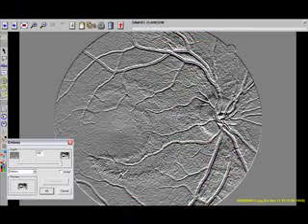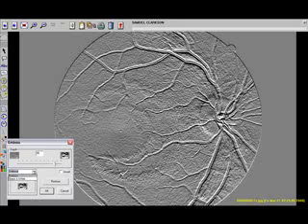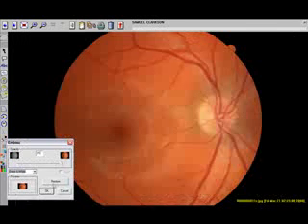The embossing button gives the effect of 3D from one picture. If you wish to make the picture black and white, use the pull-down window to go to black and white and slide the color out of the image.